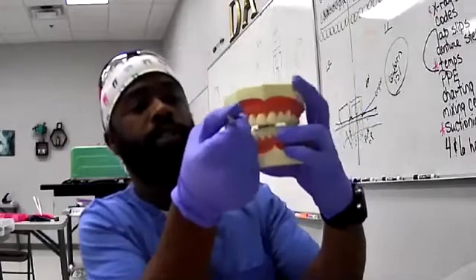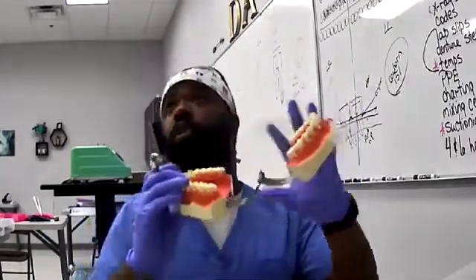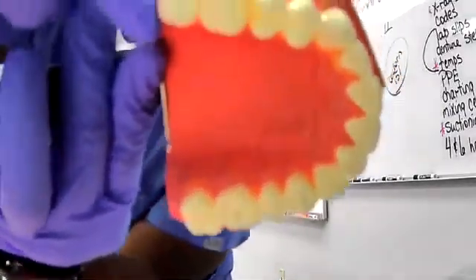Once it opens, if there are any hot spots on the tooth, it'll show it. So can you see? You probably can't see, but this tooth has some blue marks on it.